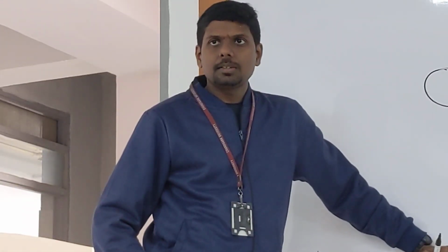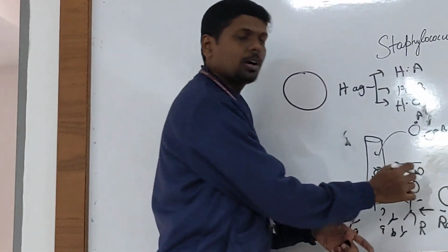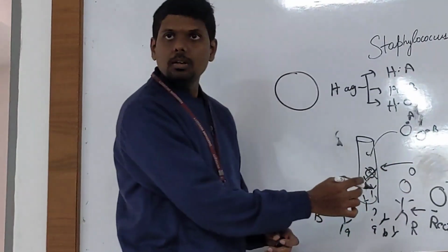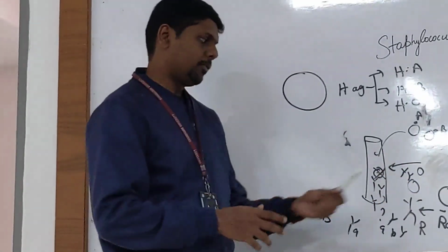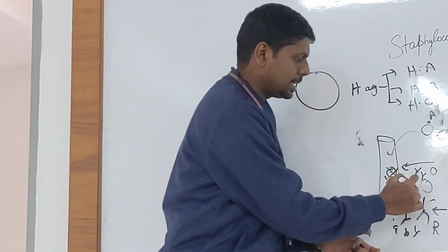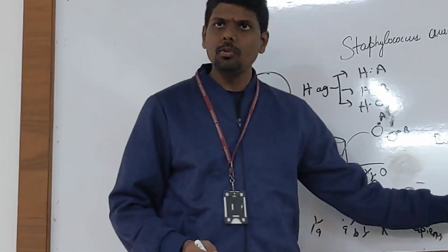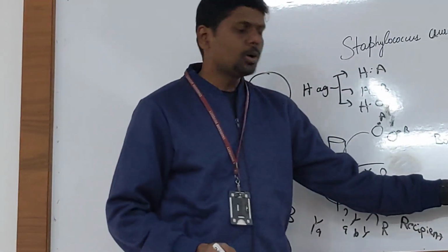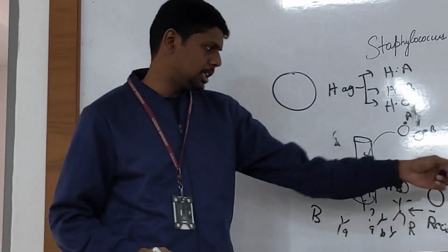You didn't get it. In O negative, his blood was O group. What antibodies might he have? He has A antibody and B antibody. Okay. We know that A and B antibodies are present. But are we giving any such group? Here we are giving O group only, and O group doesn't have any antigens. Yes, sir. So ideally he should not get any reaction in this transfusion.